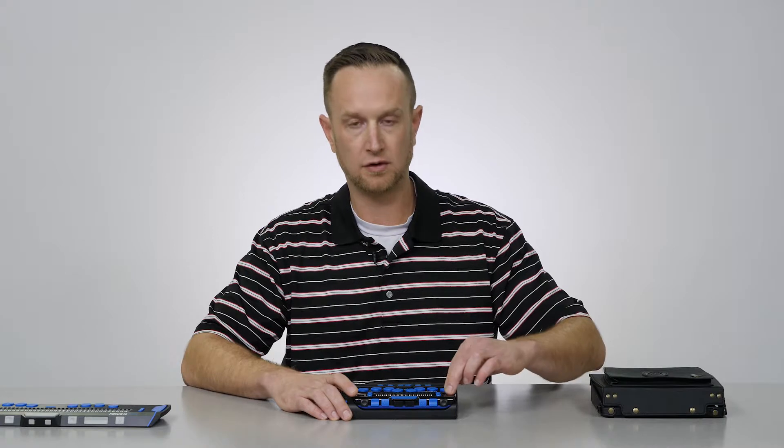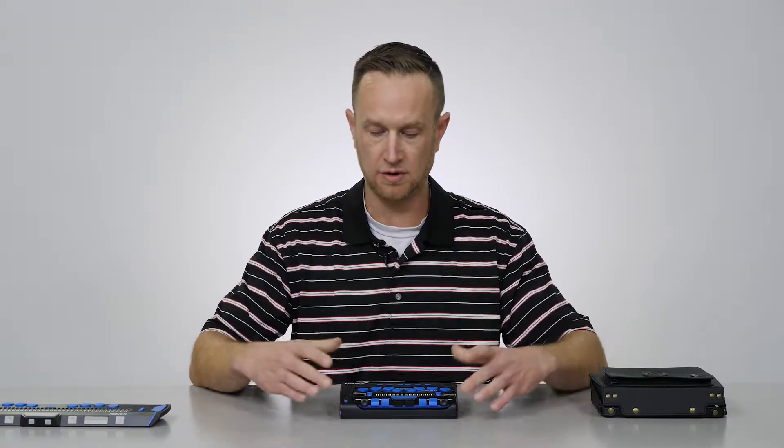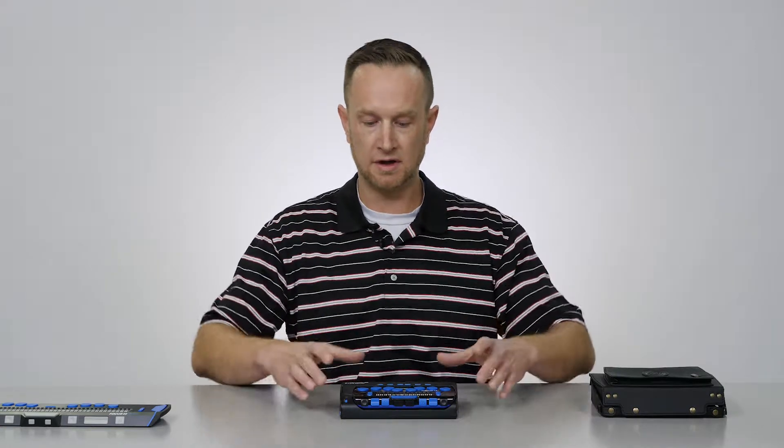If you are already a JAWS user you can use your current license and just get the Focus 14 and the LBraille. If you're already a current JAWS user with a JAWS license and a Focus 14, then all you would need is the LBraille. So essentially to get the LBraille working you would need those three different parts: the LBraille note taker, the Focus 14 Blue Braille display, and JAWS software. But if you have any of those components you wouldn't have to get them.